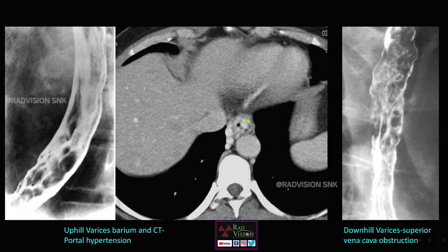On the corresponding CT you can see multiple esophageal and paraesophageal varices in the lower one-third of the esophagus. Here also you can see multiple serpiginous well-defined filling defects noted in the upper or middle one-third of the esophagus — these are called downhill varices. Remember: uphill varices occur in portal hypertension with multiple esophageal and paraesophageal varices in the lower esophagus, whereas downhill varices are seen in the upper or middle esophagus.